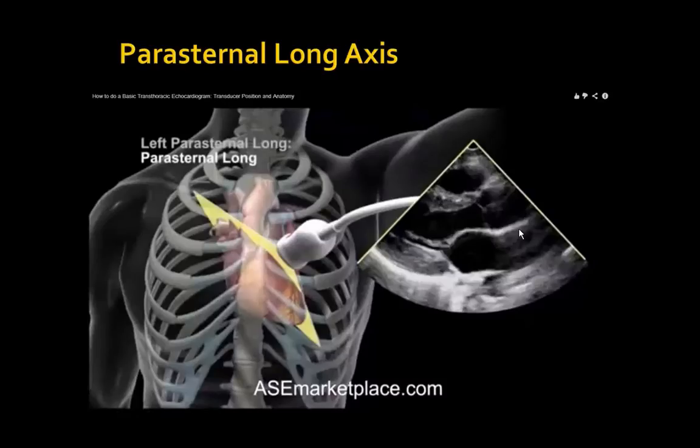And just to show what the anatomy looks like, I hardly ever get a patient with a heart this vertical. They're usually more like this, but okay, whatever. This is what it's going to look like on the screen. Apex is over here, base of the heart is here. We've got our left atrium, mitral valve, left ventricle, aortic valve, aortic root exiting the left ventricle, interventricular septum, little portion of the right ventricle, and we don't see anything else in the heart here. This is our left ventricular free wall, bright white pericardium wraps around.